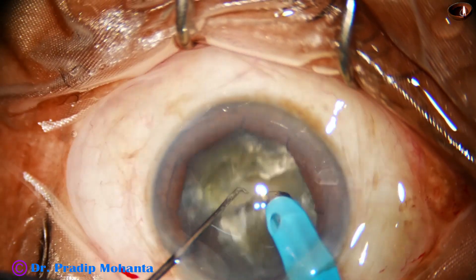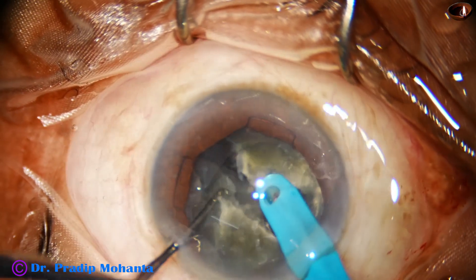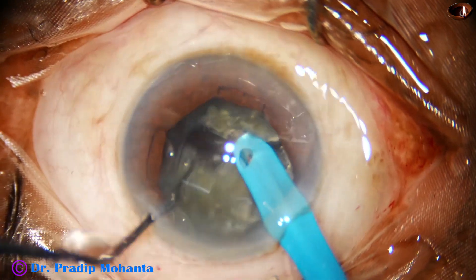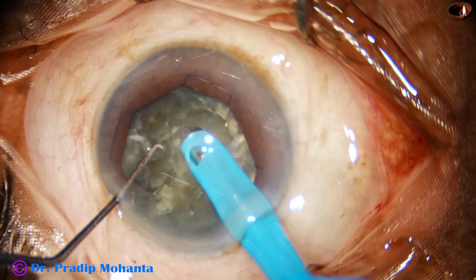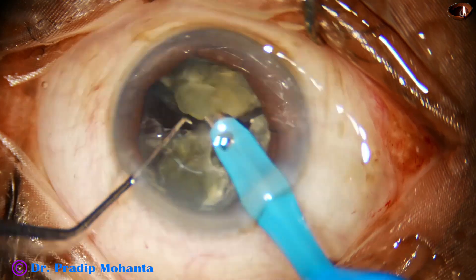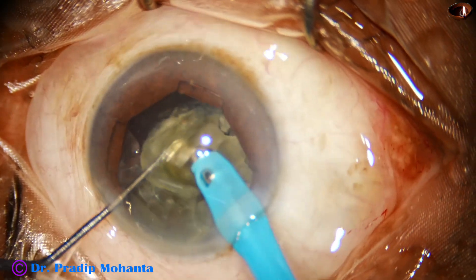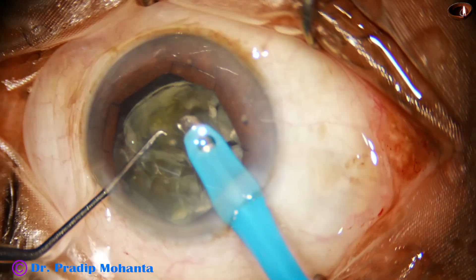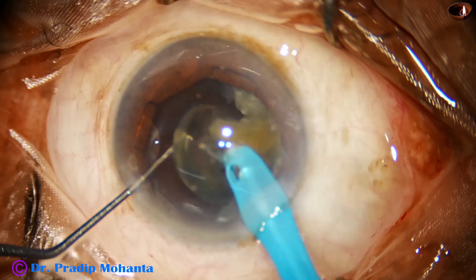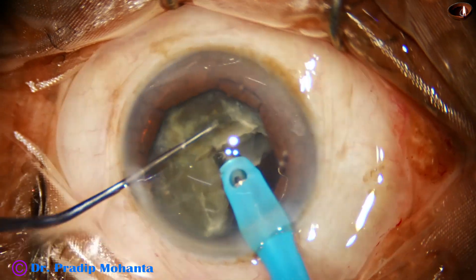Now visibility is excellent, and direct chop is carried out. We divide the nucleus into many fragments and then start emulsifying the pieces. Ultrasonic energy used is 75%, flow rate is 48 ml per minute, and vacuum is 480 mmHg in this case.